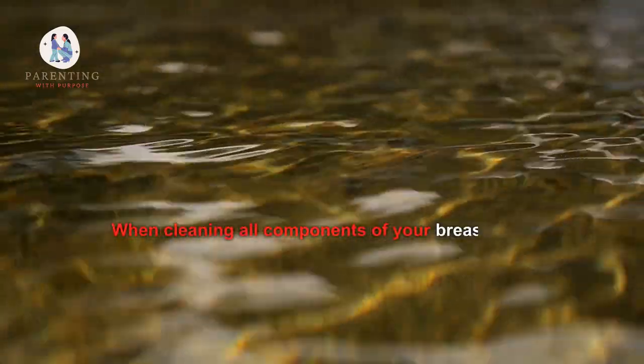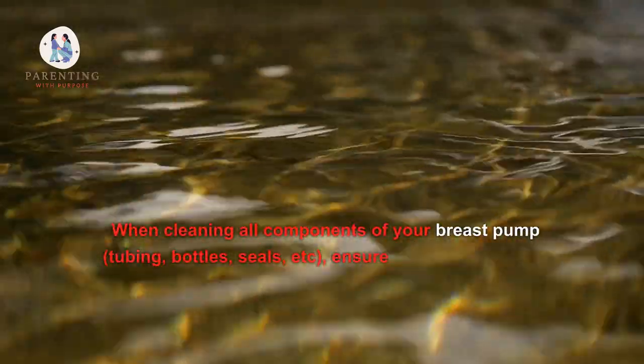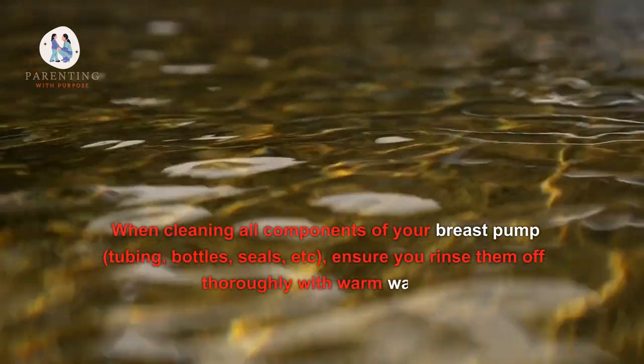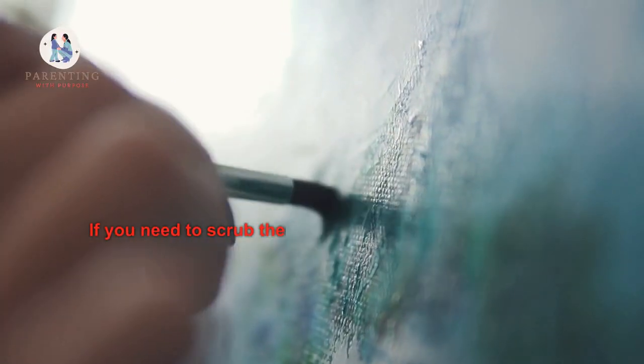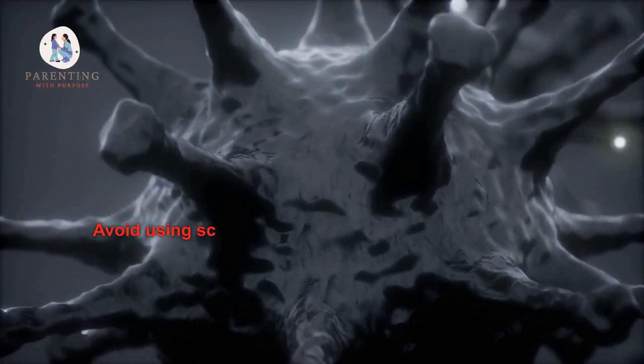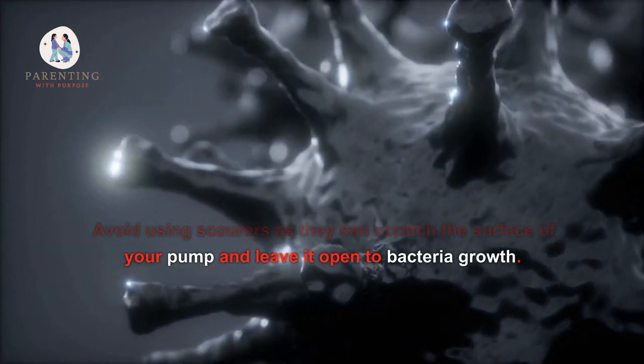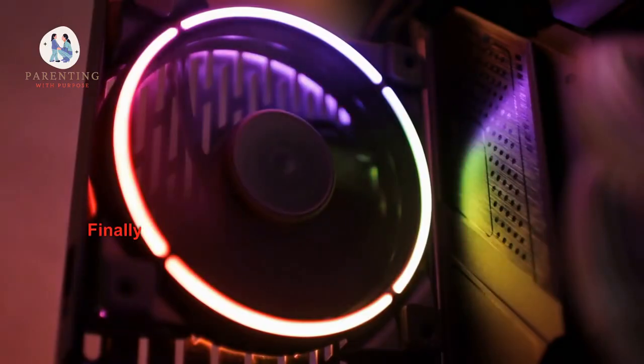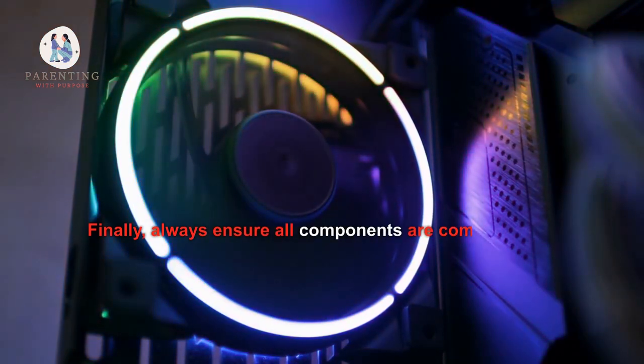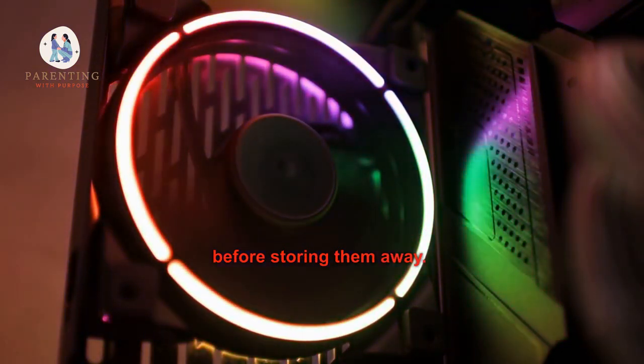When cleaning all components of your breast pump—tubing, bottles, seals, etc.—ensure you rinse them off thoroughly with warm water. If you need to scrub them down, use a soft brush or cloth and scrub gently. Avoid using scourers as they can scratch the surface of your pump and leave it open to bacteria growth. Finally, always ensure all components are completely dry before storing them away.